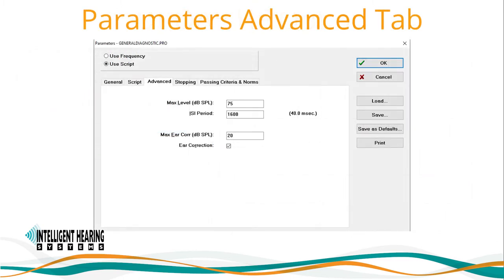Moving on to the third tab of the parameters menu, we find the advanced fields where you can define the maximum output level and the ISI period. Please note you should never test beyond 75 dB SPL, otherwise you can create artificial distortions. For ear correction, not all ear canal volumes are the same. The Smart DPoAE software offers in-ear auto-calibration to account for variations in cavity volume after probe insertion. To activate this feature, check ear correction in this tab and enter the allowable range for correction. The maximum allowable range is 20 dB SPL.